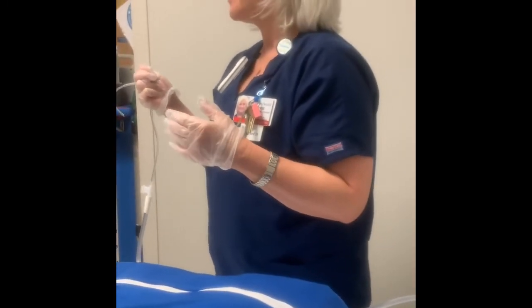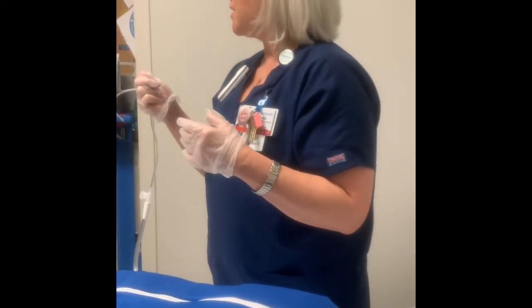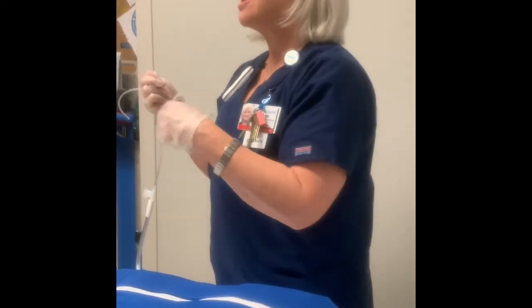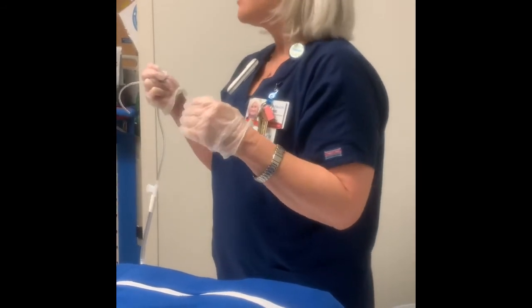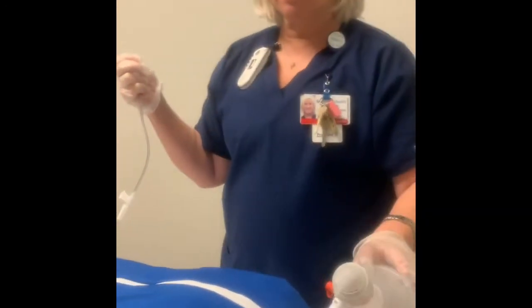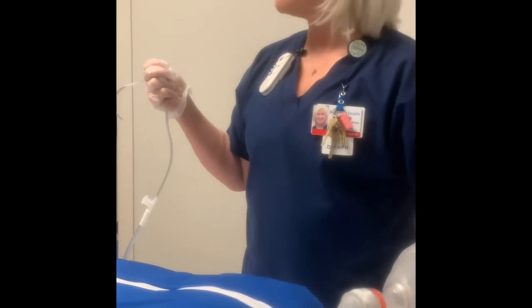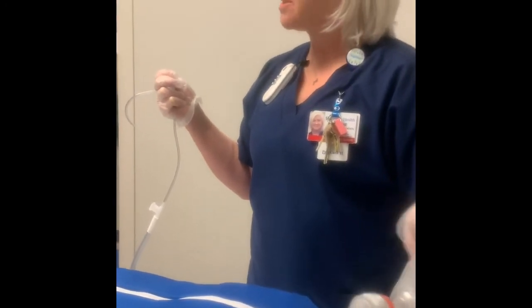And he says to me, you ever felt like a vacuum cleaner in your lungs? And it's just pulling, there's no way you can take a breath because you're sucking everything out of me. So you'll need to ambu this trach here, suction, or give them about 100% of a few deep breaths here. Then you want to go down.